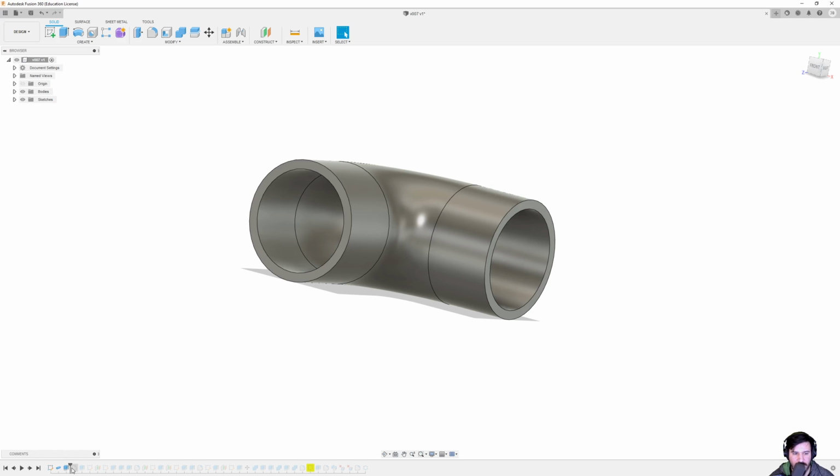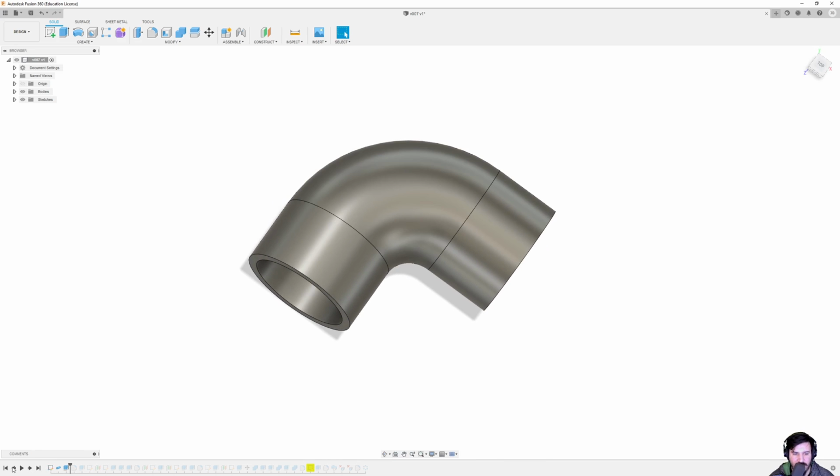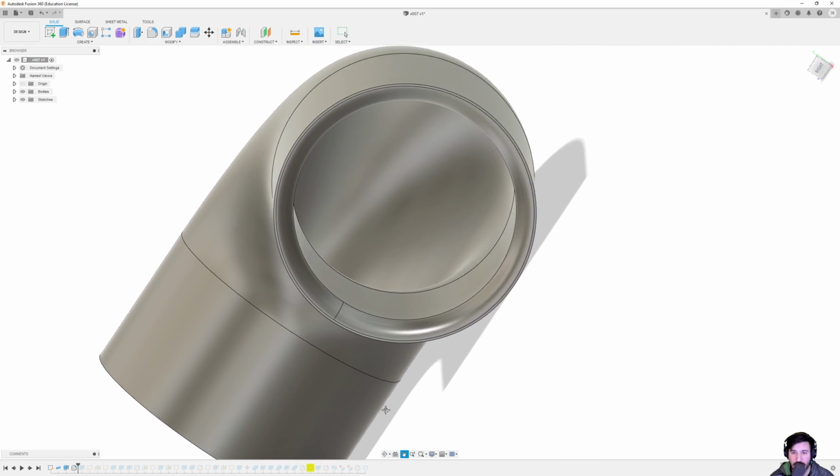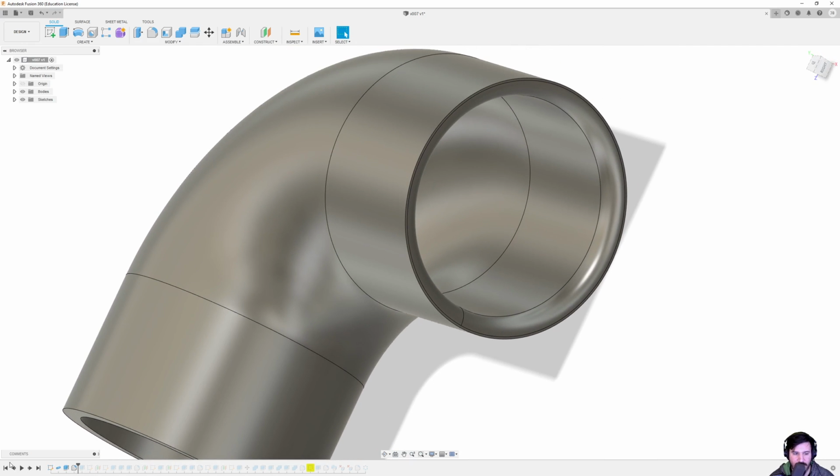Next, what I did was, let's see, extrude. So I changed the length on this. It doesn't look like I actually changed it all that much. It's possible that that part was not used. Beats me. And then I put a fillet on the edge here, just to make it a little bit easier to insert the mating part to this. If I go back in time, you can see it's just a flat edge. It just makes it a little bit easier if it's self-correcting.